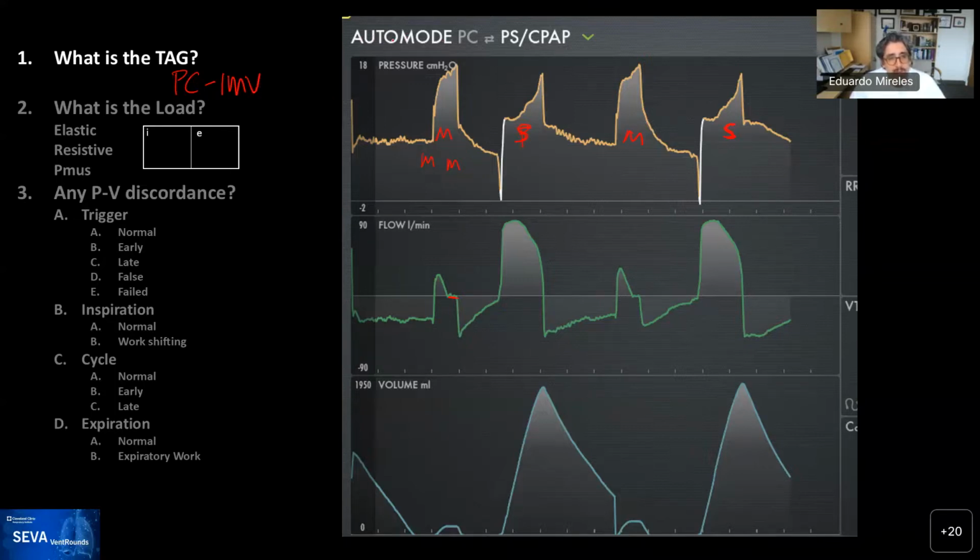Now in the auto mode, the type of IMV that it takes is type 2, meaning that spontaneous breaths will suppress the mandatory breaths when they reach a certain threshold. Different algorithms may have different ways of implementing it. It may be the average of a number of seconds before the last breath, or it may be within a minute or whatnot, but it will suppress the mandatory breaths.